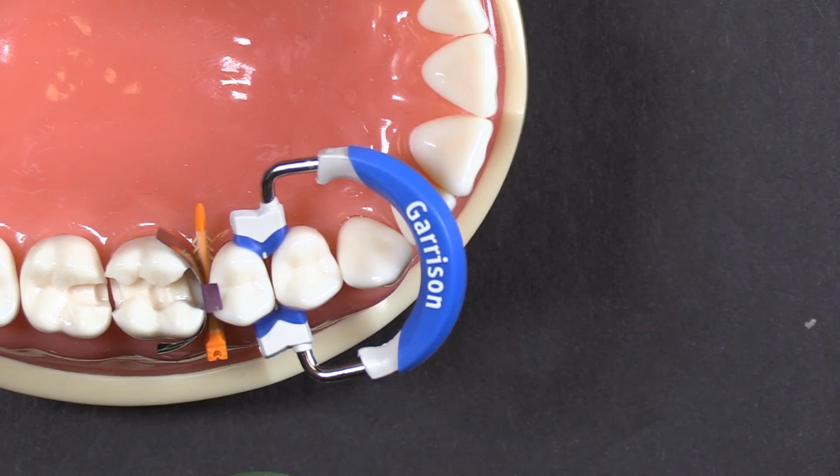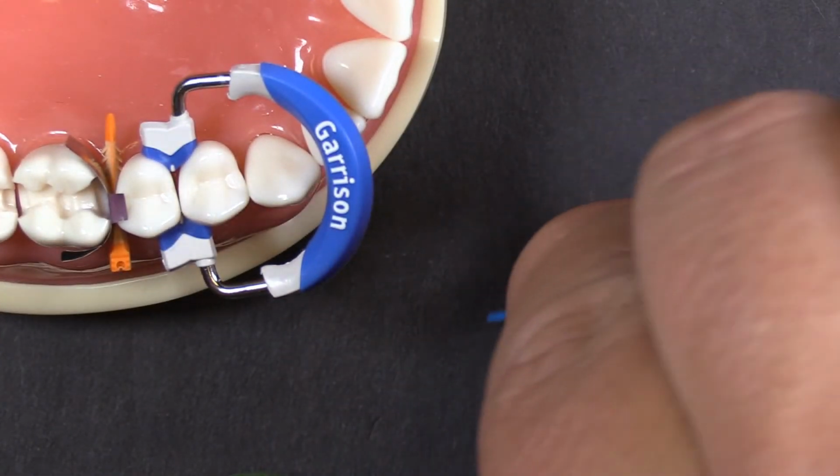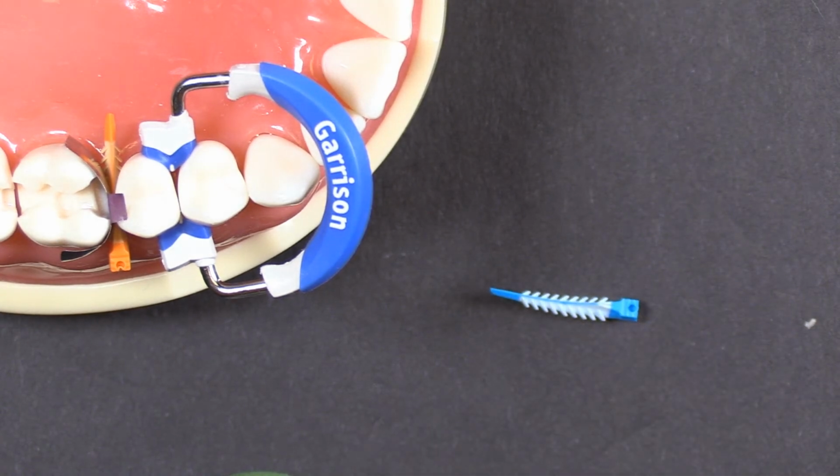So if you're infrequently experiencing too tight of a contact, I would suggest that you're just experiencing natural variation in the mobility of the dentition. If you're having it very frequently, you're probably wedging a little bit too firmly. So maybe try backing off on your wedge size a little bit. To give you an idea, the most commonly reordered size of any of our wedges is the blue, which is the next to smallest. So watch that.